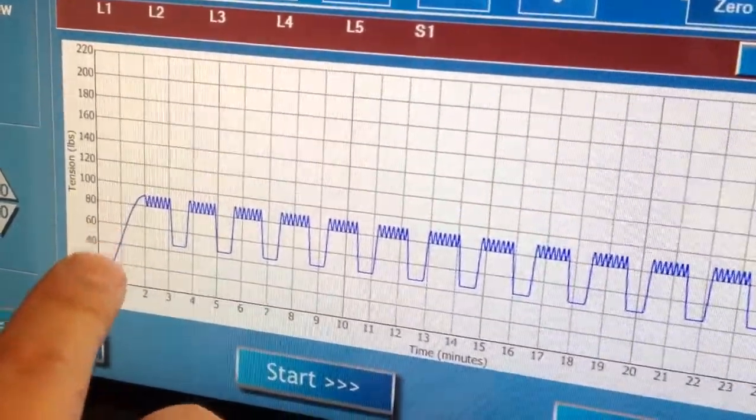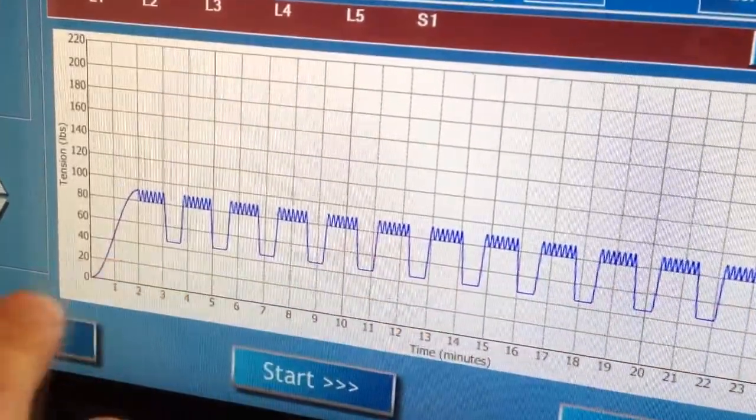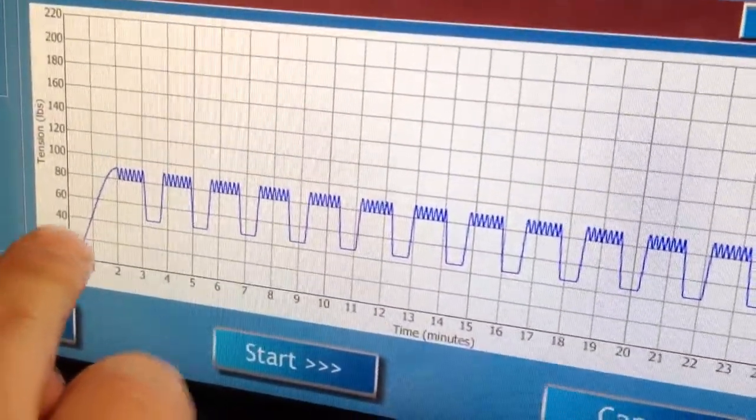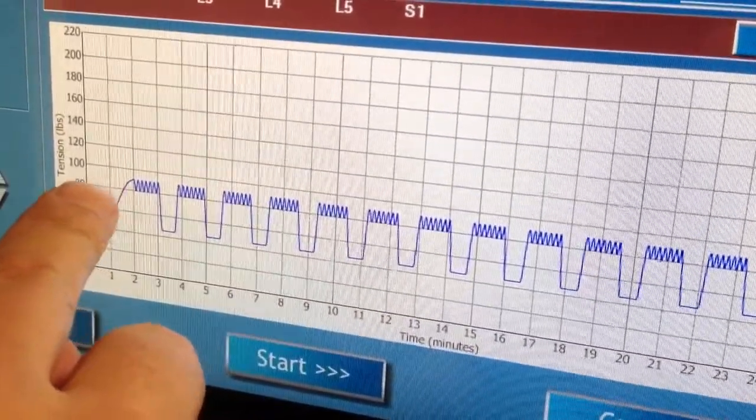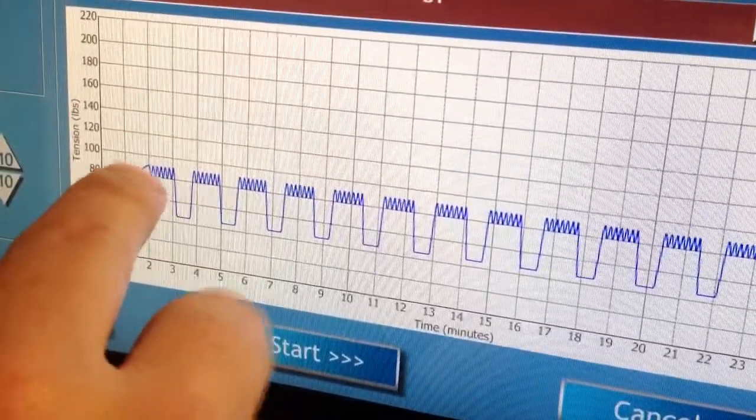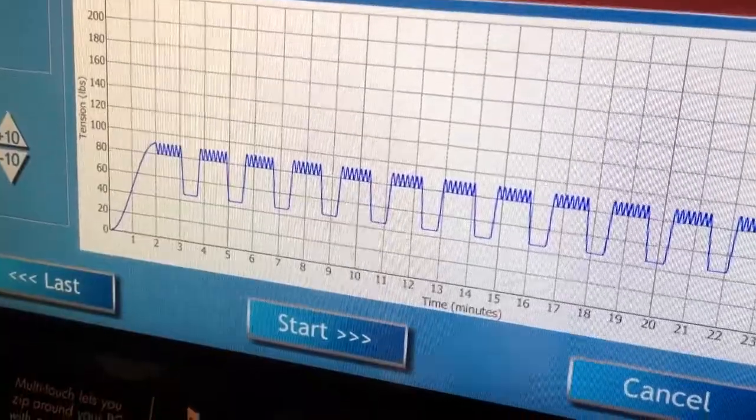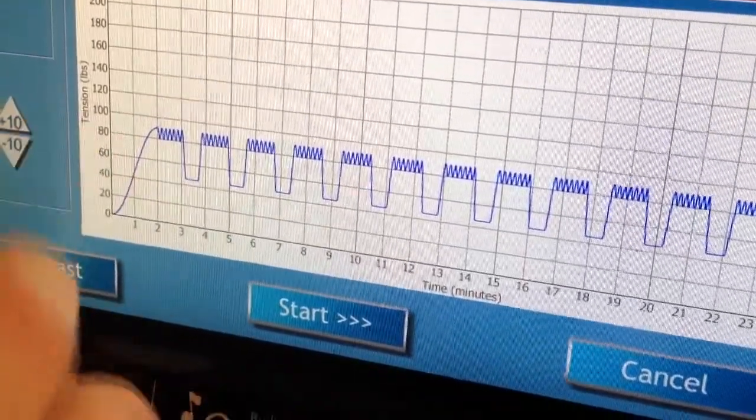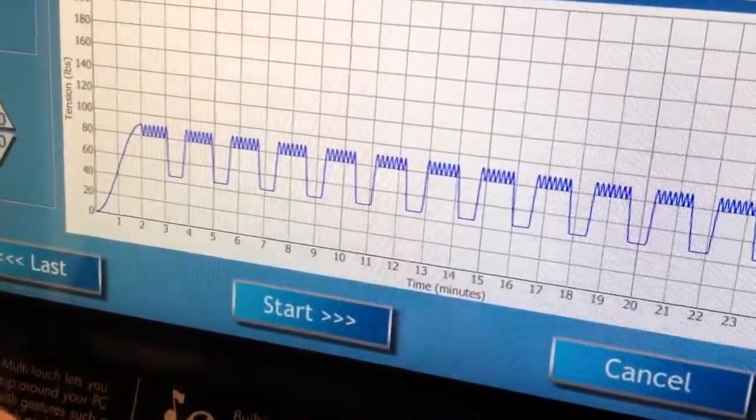So this is what an IDD therapy typical treatment looks like. We have a high distraction force, in this case it's 90 pounds, and then at the top when the joint is open we have this oscillation which presently is 10 pounds.